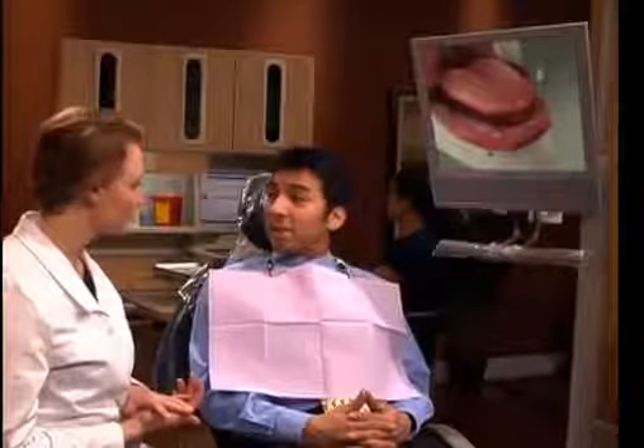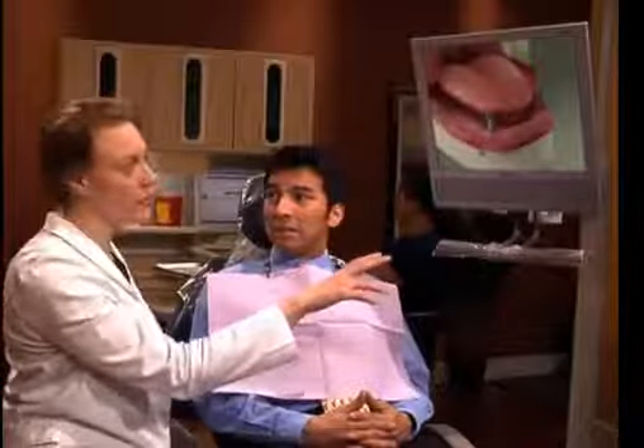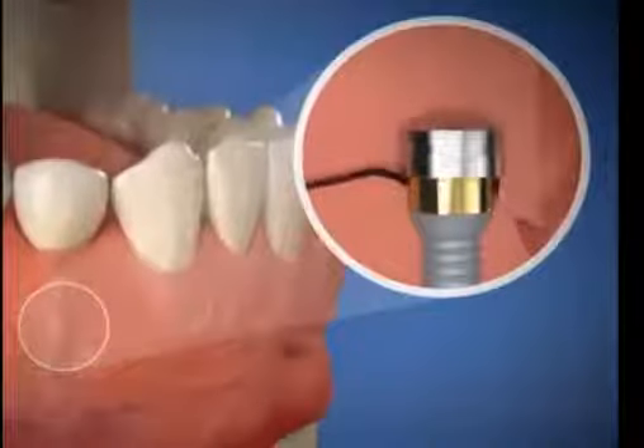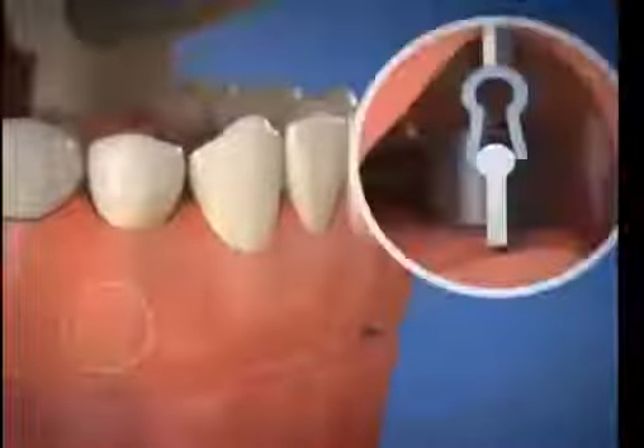When all the teeth in an arch are missing, an excellent treatment for replacing them is a denture secured with implants. Depending on your situation, the denture may snap onto the implants in your jaw, or it may clip to a bar that's attached to the implants. These systems keep the denture secure in your mouth, but allow you to remove it when necessary.